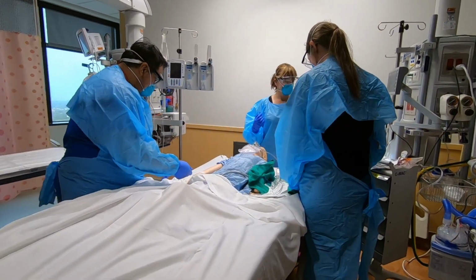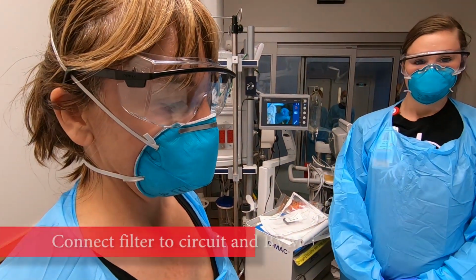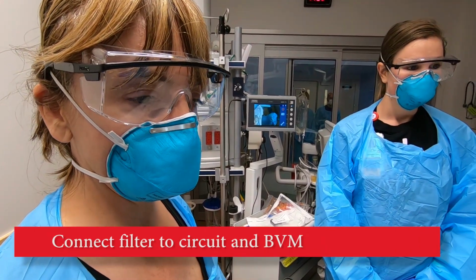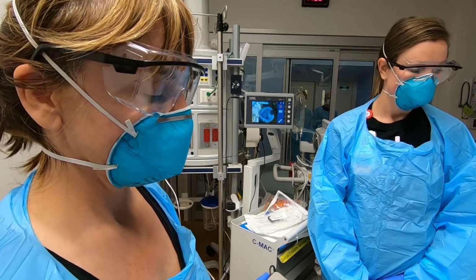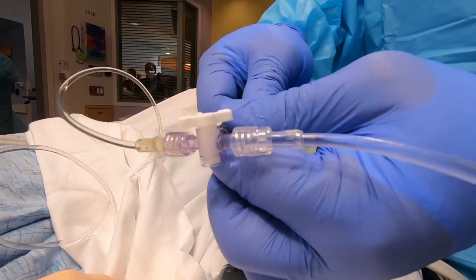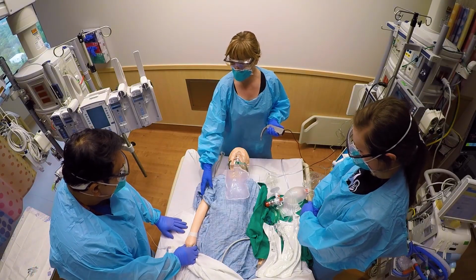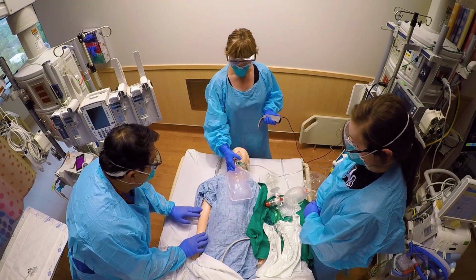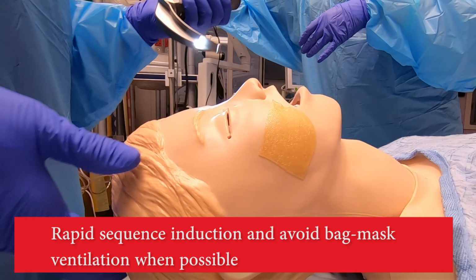The most experienced intubator, the team lead, should be intubating. So let's go and give 2 mics of fentanyl per kilo. Patient moving. Patient is not moving. They don't see chest rise. I'm going to go up to intubate.